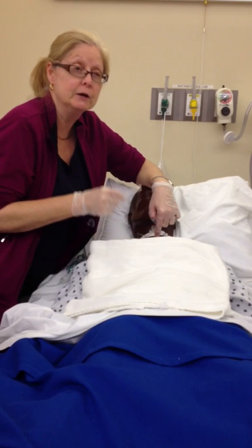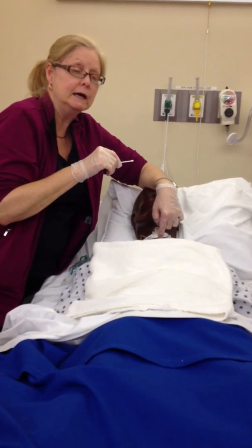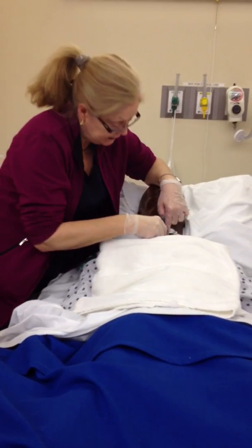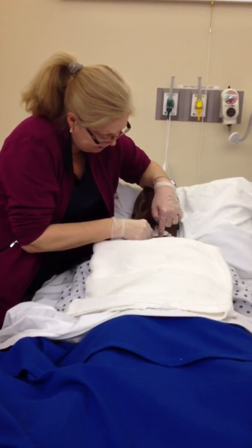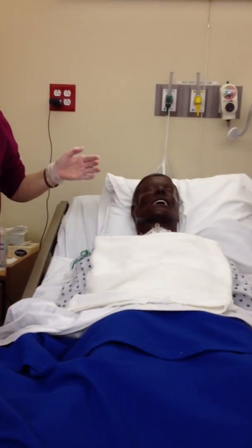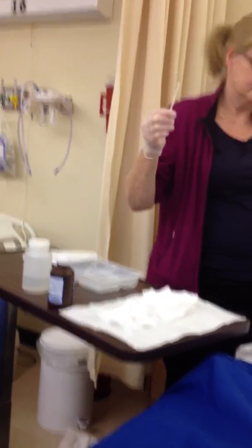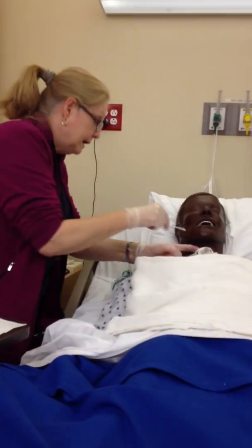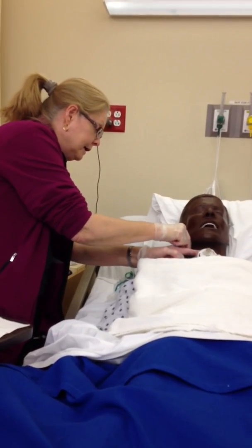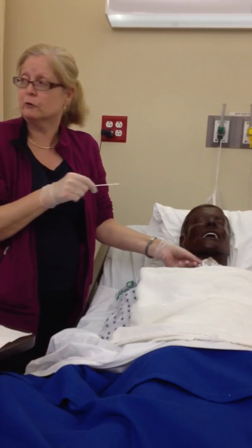We're cleaning down here. And you're going to go a half moon, one direction, distal to proximal. So we're starting away, half moon, we're coming here, and then we're going to drop, and you can even drop it back in here because that part is dirty anyway. Then I'm going to pick up my other swab, and I'm going to come up here, and I'm going right around the meatus of the trach, the opening of the trach.